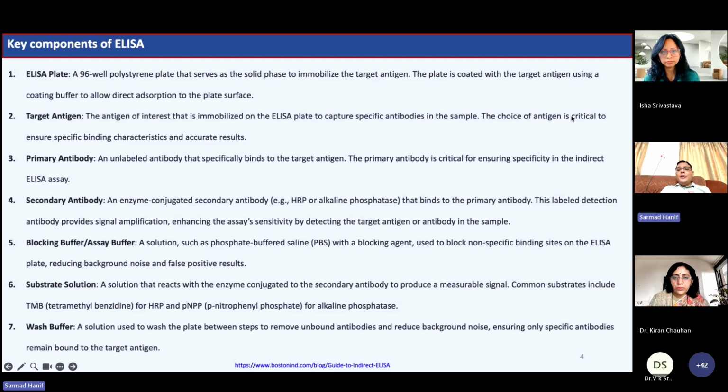So what we do is we have a mixture in which we take a protein, a non-specific protein, which is not similar to the antigen. Here in this case, the antigen will be polysaccharide. We mix it with a protein which will not give any kind of readings or any kind of hindrance in the ELISA. We mix it and then we coat it. So what it does is that the protein goes and binds to the well.